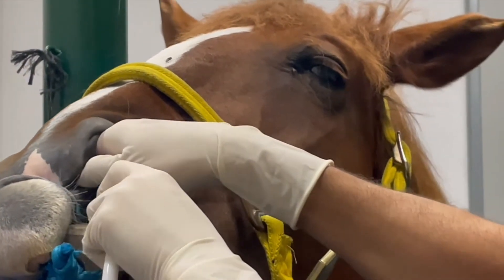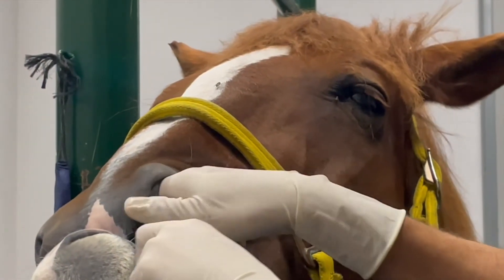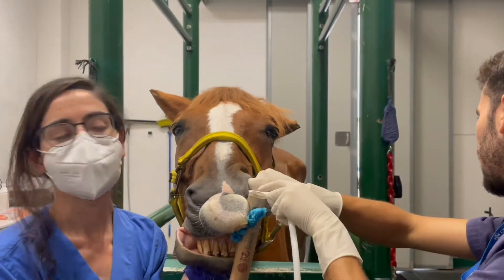And the third, operating the lavage catheter, infusing the lavage solution, and aspirating the sample, which is Patrick — although you won't see her apart from the hands.